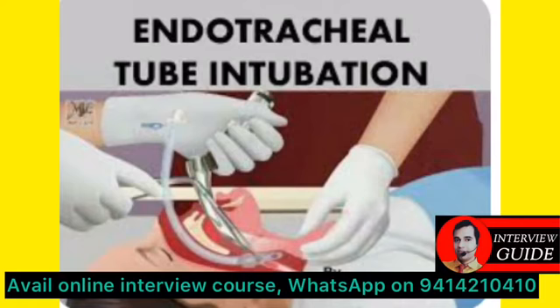After reaching there, we have to properly visualize the glottic opening. To visualize the glottic opening better, we can also apply pressure on the thyroid cartilage. That is the BURP method: backward, upward, right side pressure on the thyroid cartilage, so that proper alignment takes place and we can easily visualize the glottis. We can also apply downward pressure on the cricoid, which also helps in visualizing the glottic opening.